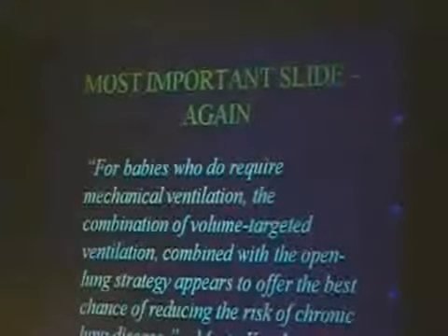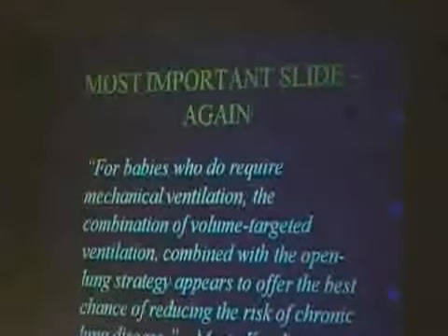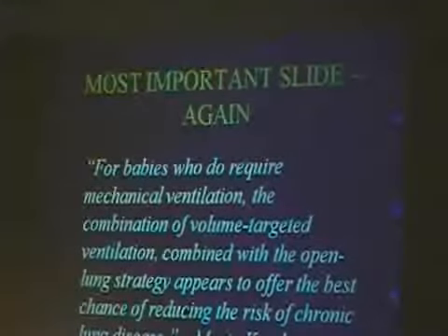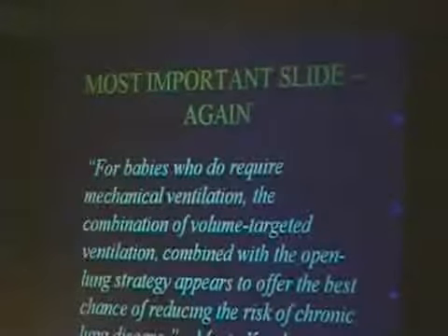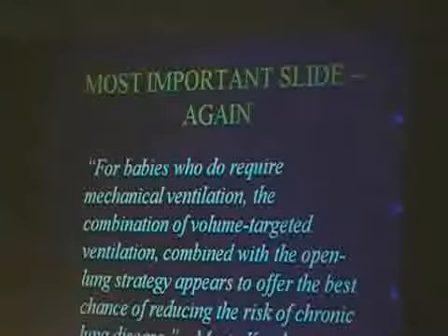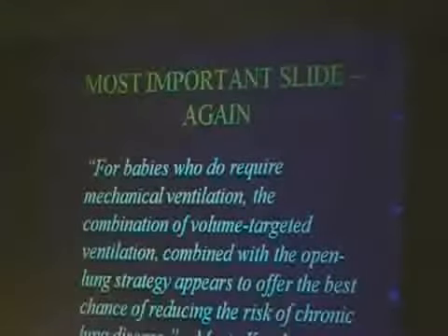It's a pressure mode. So you're still setting the PIP. But then it adjusts. Most people set the PIP fairly high, because otherwise your machine may alarm a lot. Remember that the set PIP is never going to be attained unless your volume is not delivered.